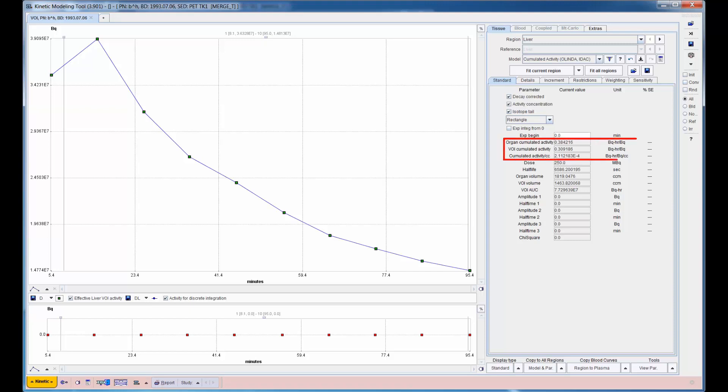The resulting accumulated activity is adjusted to the standard organ size and normalized by the injected dose. This procedure is applied to the curves of all organs.